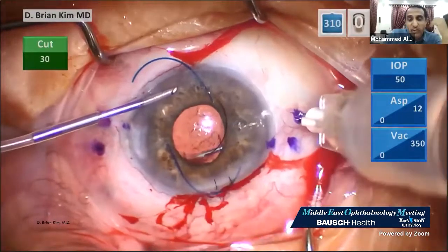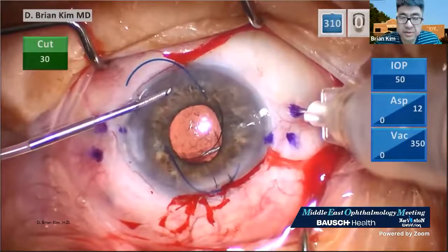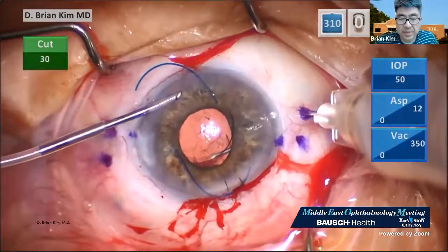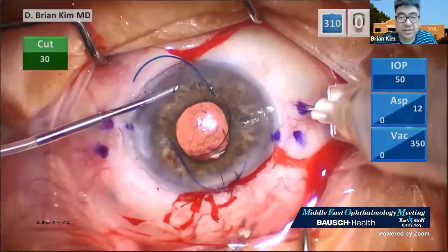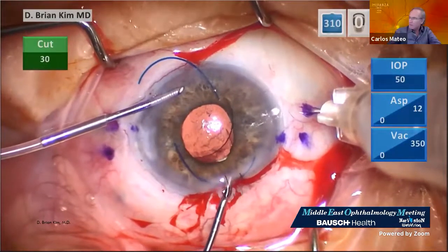Brian, if you want to comment while the movie is working. Oh, can you? So now, I put the trailing haptic first. Can you hear the narration or no? Yeah, I can hear you very well. Can you stop it, Brian?